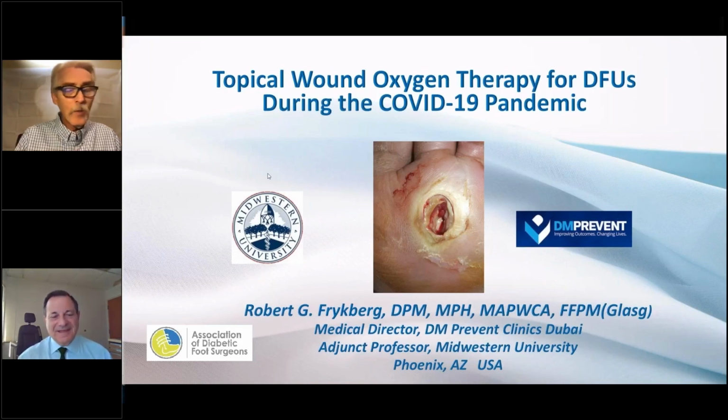Well, the person who asked the question is very astute, because, as I said at the very end, this technology lends itself very well to be used adjunctively, not just with standard of care, but with any other type of tissue product that you might like. Because remember, it produces a robust bed of granulation, really jumpstarting these wounds to allow them to rapidly heal. Remember, the increased VEGF, increased angiogenesis, increased tissue oxygen tensions because of the increased angiogenesis, building a good bed of granulation on which you can lay a skin graft or any other advanced therapy.